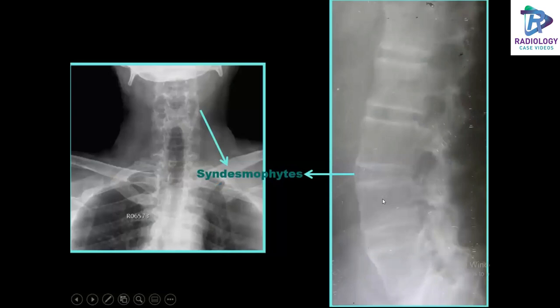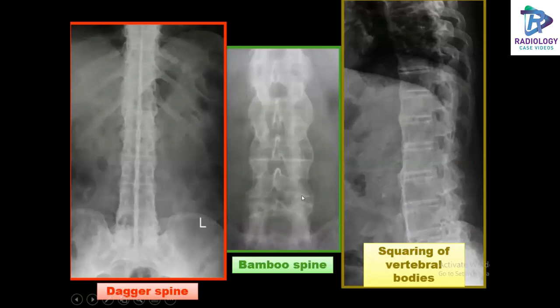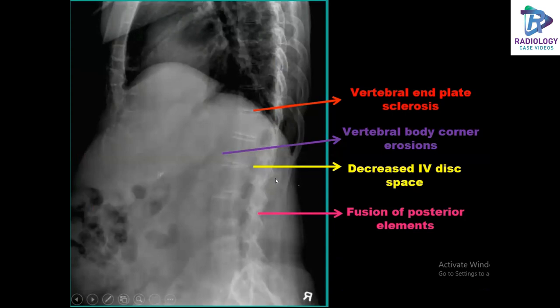These are frontal and lateral radiographs of the spine showing the most commonly found features: the dagger spine, the bamboo spine, and squaring of vertebral bodies. Lateral radiographs of the spine also show vertebral end plate sclerosis, vertebral body erosions in the corners, decreased intervertebral disc space, and fusion of the posterior elements.